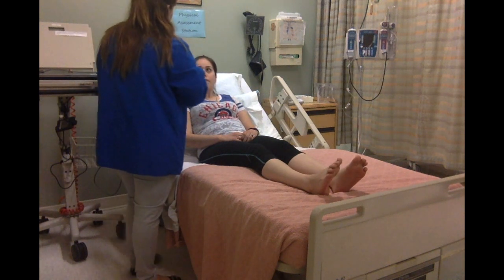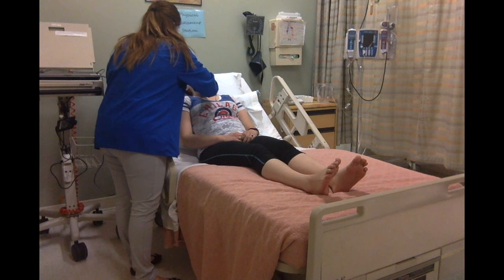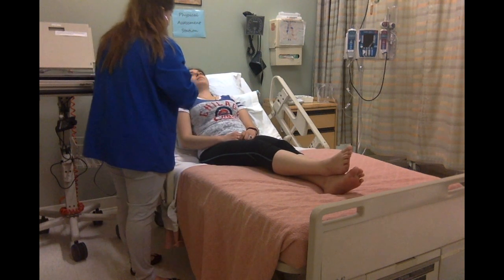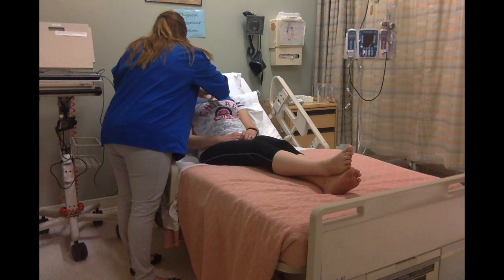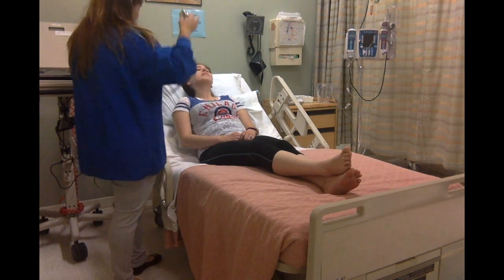So actually, first I'm going to feel your carotid pulse. Now I'm going to listen with the bell of the stethoscope. Okay, so I don't feel any bruits. Good.